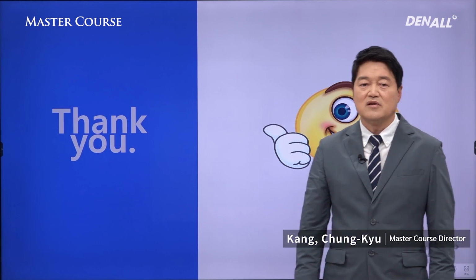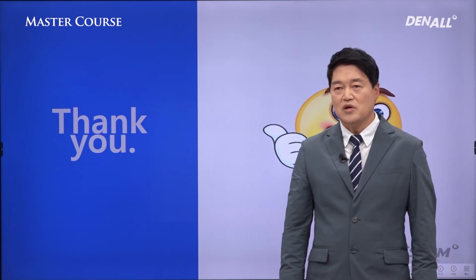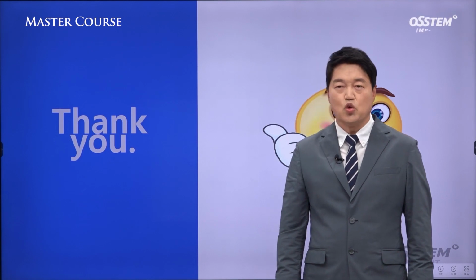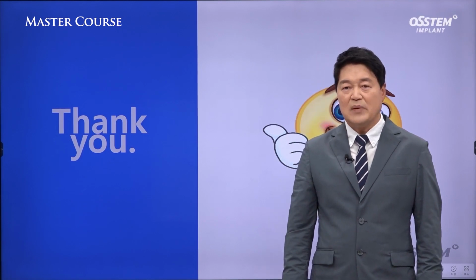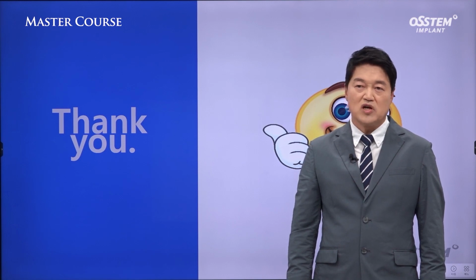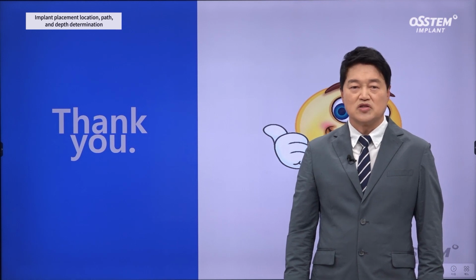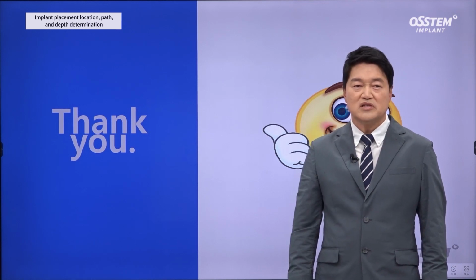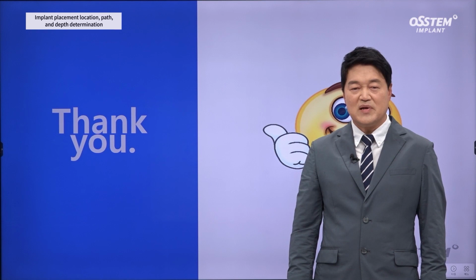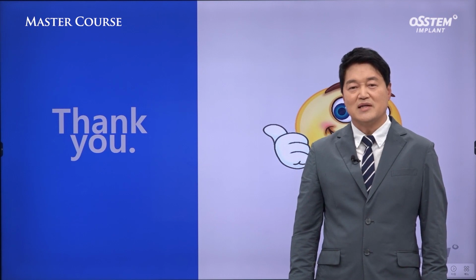Up to now, I have talked about placement direction, position, and depth, and what needs to be considered for those. Once the implant is placed, we cannot adjust the direction. So from the planning stage, we need to ensure the depth, location, and path of an implant. That will be very important for future prosthesis in terms of its stability.